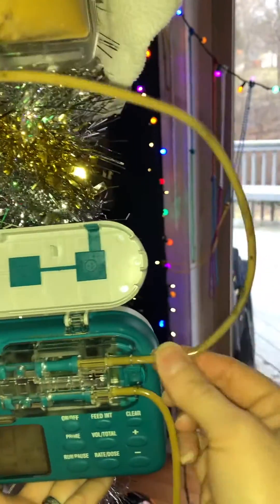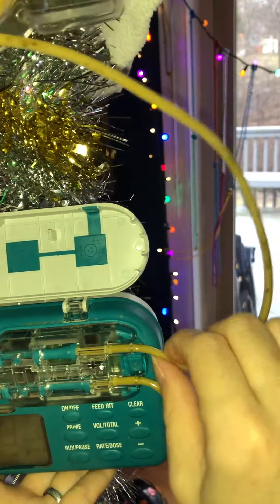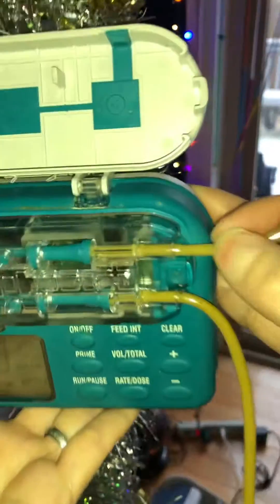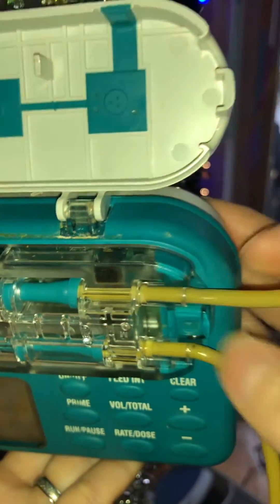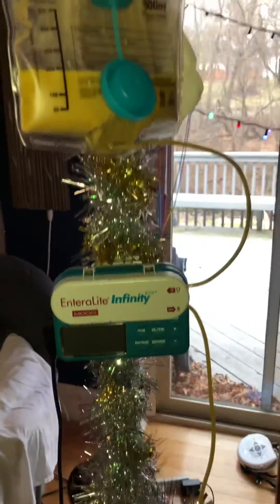Moving the pump up versus the bag — the tube now seems to be a little more straight and that kink is gone. So I'm gonna tighten back the back side of the pump, close it back up, and restart the run. Hopefully that works.